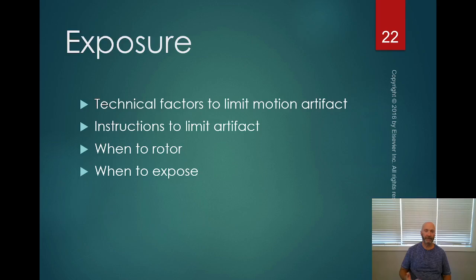So consider your technical factors. Make sure that you give the patient good instructions on how to dress and what to remove so that you limit your artifacts, but also your motion artifact. And I think that's what I was going with there. Give them good instructions so that you can limit the motion artifact.